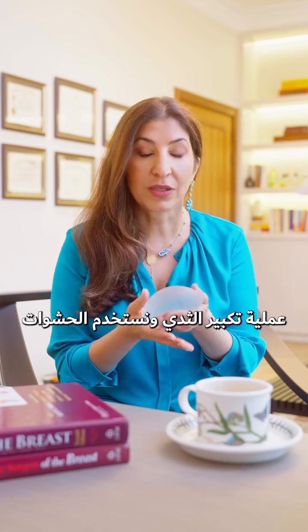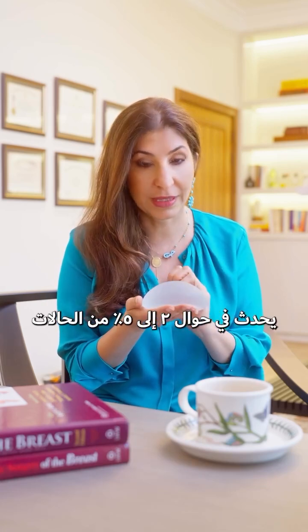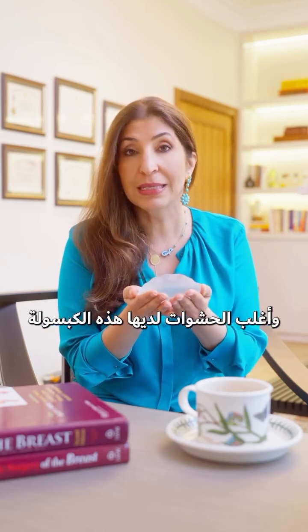What is a capsular contracture around an implant? Now, sometimes when we do breast augmentations and we use an implant, the body creates sort of like a scar tissue capsule around the implant. And that happens at about 2 to 5%. And what it is, it's a scar tissue that occurs around the implant. And most implants have it.